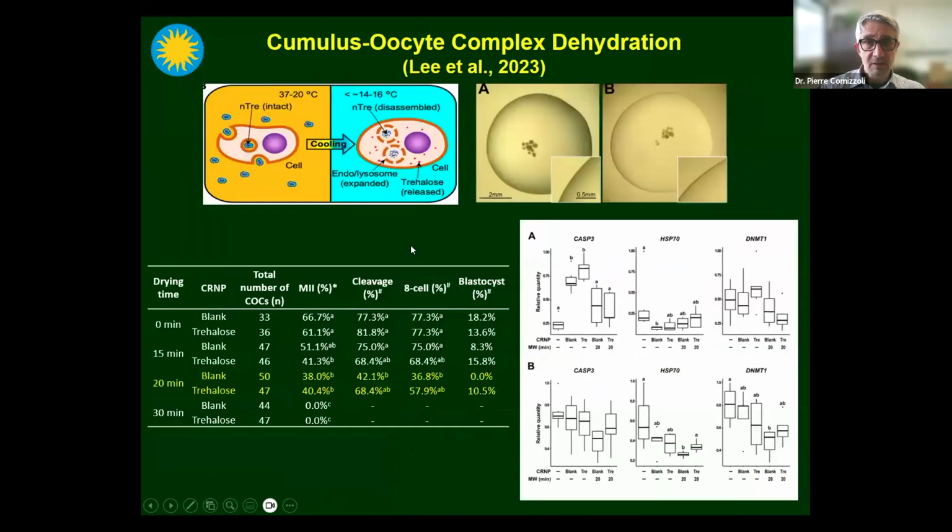More recently, what we've done for oocytes is, as you can imagine, we looked comprehensively at the integrity of the germinal vesicle during dehydration, but this is still very heavy, since after that you need to inject the germinal vesicle to reconstruct an oocyte. So we went back to our original idea, which was drying the whole oocyte, the cumulus oocyte complex.